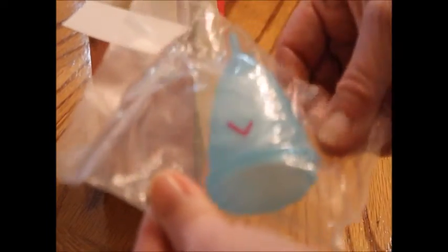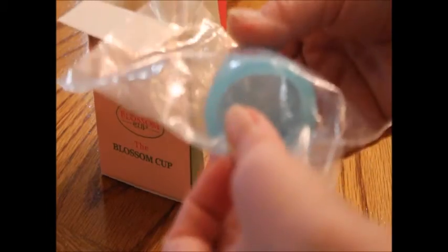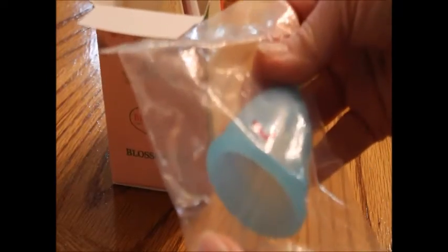The blossom cup holds a fluid ounce of menstrual cycle, and the reason that a lot of people have started using these is because of the environment. When you throw pads away, they get stuck in a landfill and stay there forever. But with these, you don't have to have a pad. You don't have to buy pads every month. You just use this and change it out or empty it two to three times a day when you're on your cycle.